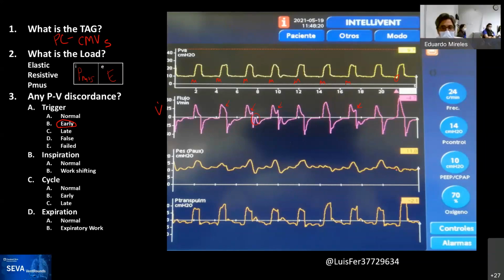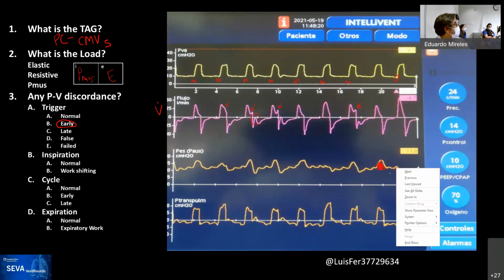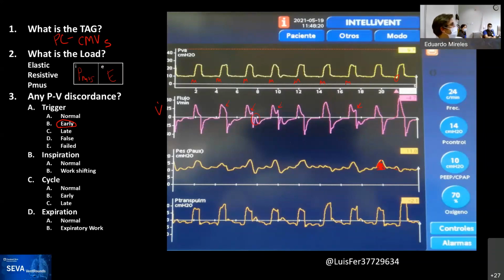I mean, based on the esophageal pressure waveform. But you don't see the climb that you see in the passive, right? Yeah, correct. So the lack of the climb is the patient is doing the effort, and the ventilator is just demonstrating this amount of support on the patient, if you may, right? So the patient is getting much more flow because he's activating now, coordinated with the ventilator, and that's why the flow changes so much, right?